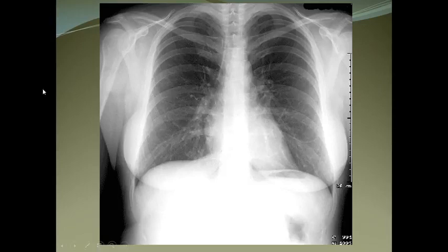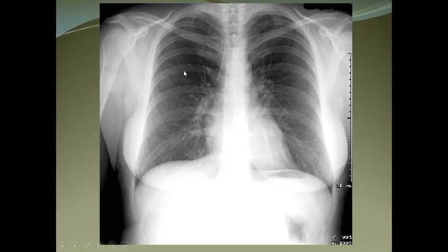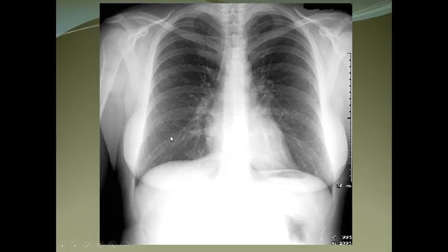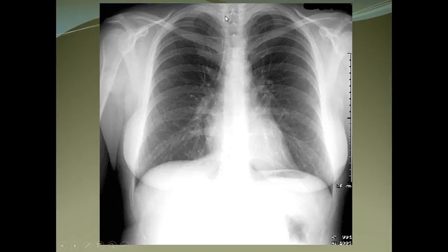This is a normal chest X-ray. You can see different densities: the clavicles, the lung parenchyma, fine bronchi and bronchovascular markings. These are the costophrenic angles — both are sharp. This is the humerus, the acromion, coracoid, and scapula. In the center you can see the trachea.